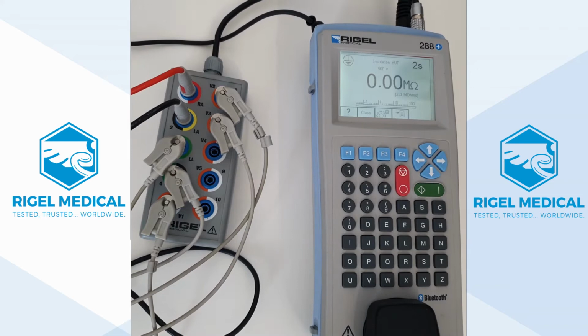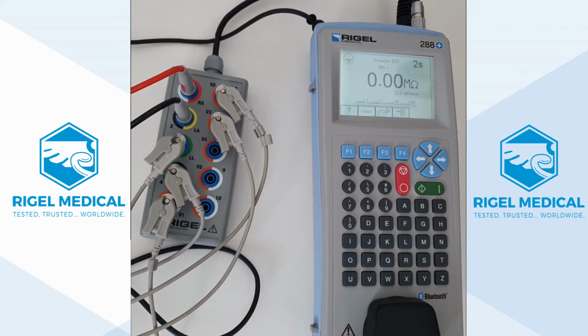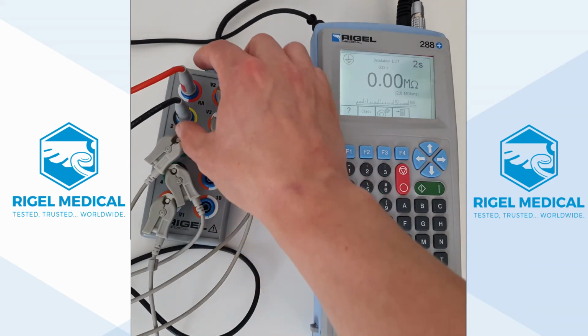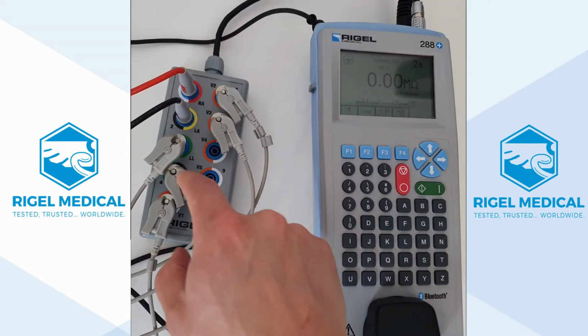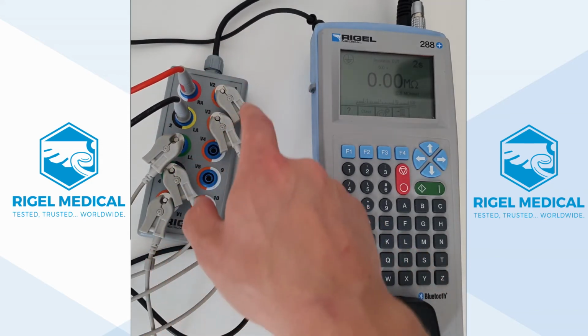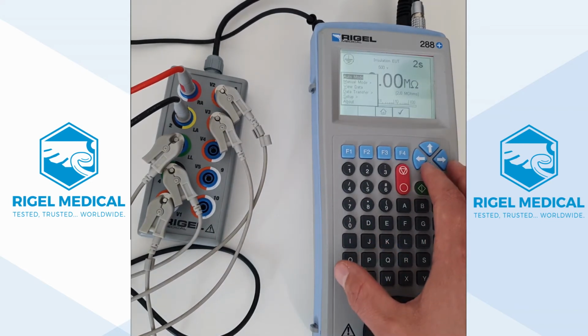So we've got a quick demonstration of how we group patient connections together for safety testing using our Rigel 288. In this case, we're going to be testing a defibrillator. With a defibrillator, you've sometimes got multiple patient connections under single functions. So we've got our defib paddles here for one single function, and we've got our ECG leads for another single function. Now the 288 groups them automatically.